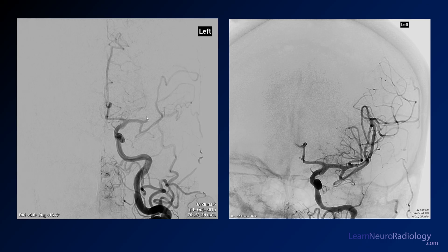These are some post-thrombectomy images where you can see they've actually gone out and recanalized that vessel. So you see that has been treated, and there's good blood flow to these downstream branches.